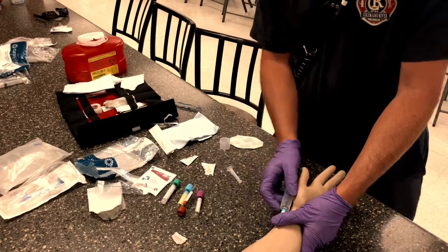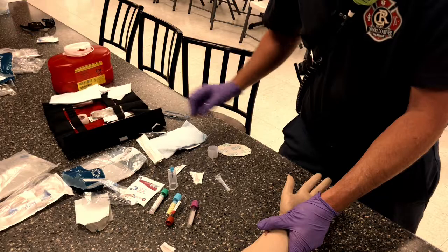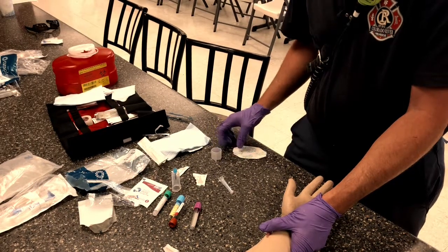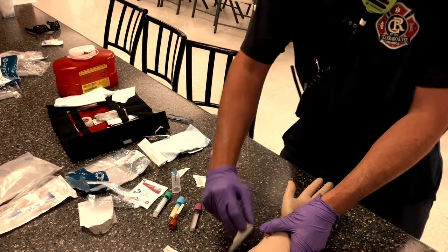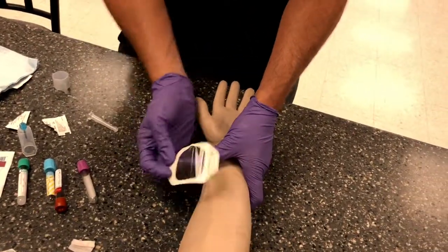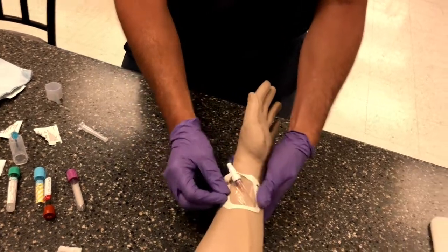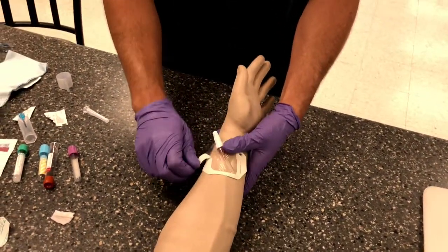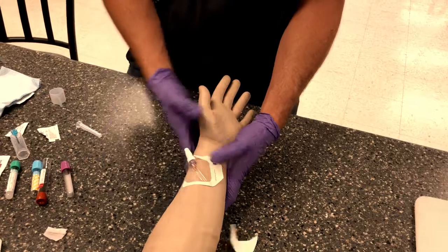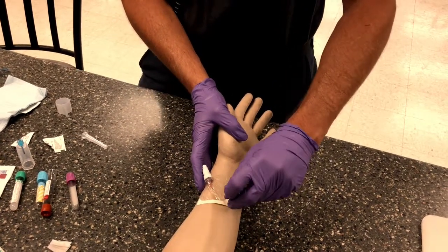Once those are complete, we can remove our blood hub, and we can take our Tegaderm and secure it to the patient. This is an initial securing device. I always recommend tape, never circumferentially.